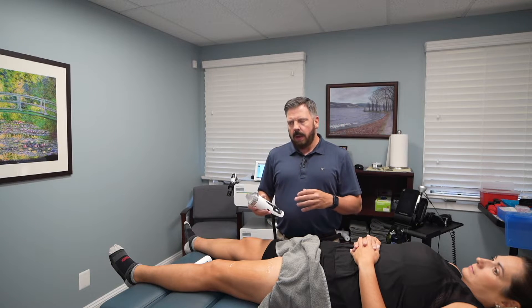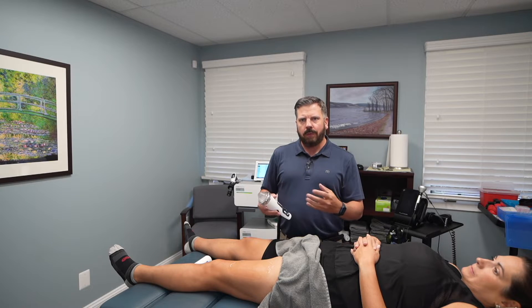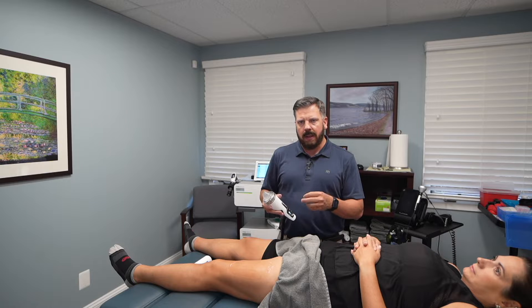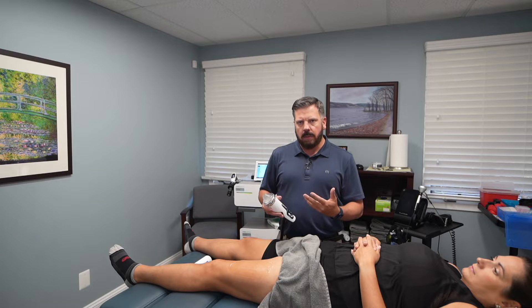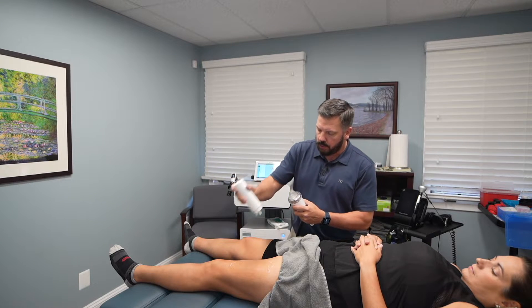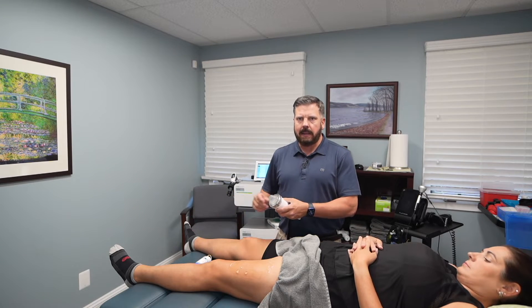With the focus shockwave, it's a little different in terms of feeling. When we go over an area where there's not a problem, you're not going to feel much — whereas with the radial, you will feel that general tapping up and down. With this one it's very specific: you won't feel much over normal tissue, but when we get over the problem spot it's going to feel like a deep, dull, intense ache right at that spot. But once I take the treatment head off, it's going to feel really comfortable and looser. We're going to apply ultrasound gel in the treatment spots and I'll show it both in the quad and also in the knee, since we often use this specifically at the knee, foot, or ankle.